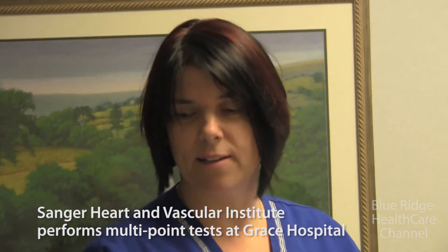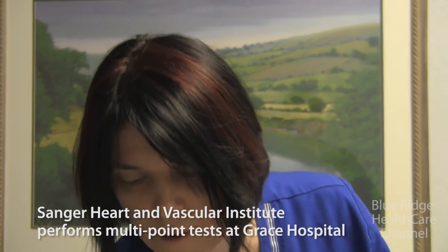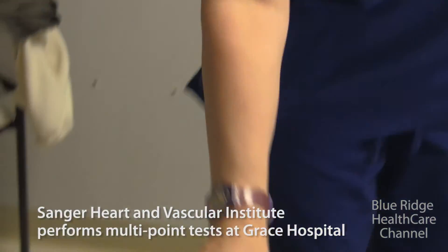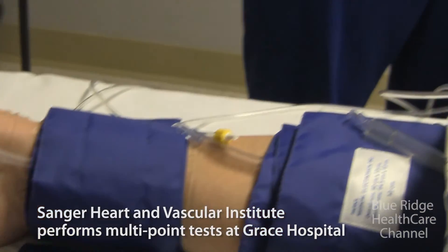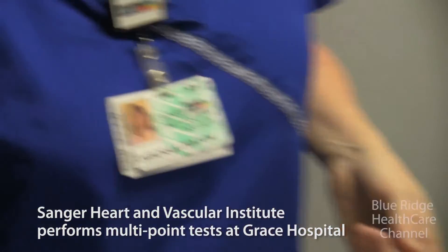So we were doing a segmental pressure — basically segmenting the leg down and taking pressures at intervals. If there's a big drop from one cuff to the next, we know somewhere in that segment there's a blockage. Pressure drops after a blockage, so it's a really simple idea.